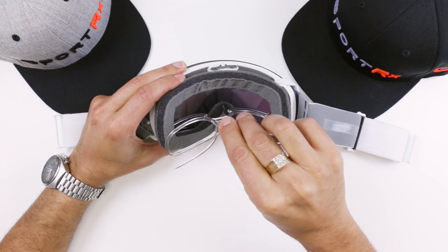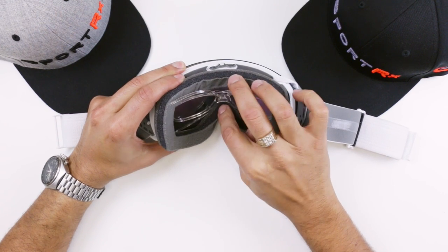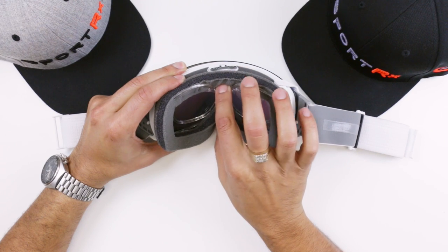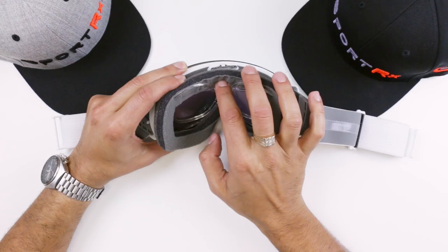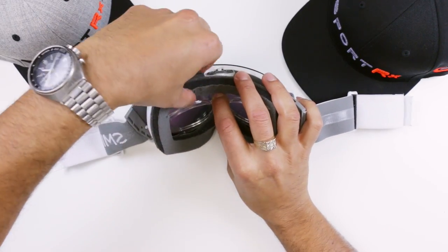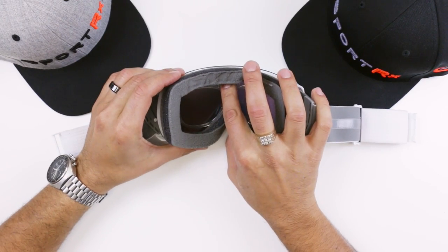Get the two bottom tabs in like that, then make sure this is going up and over here — that should guide in really easily. The next step is to get the top prongs inside the goggle. You need to roll open this foam a little bit and the insert will just kind of guide itself in there.